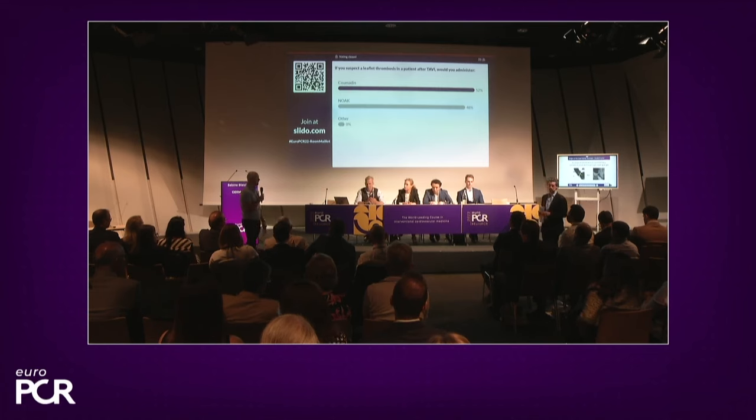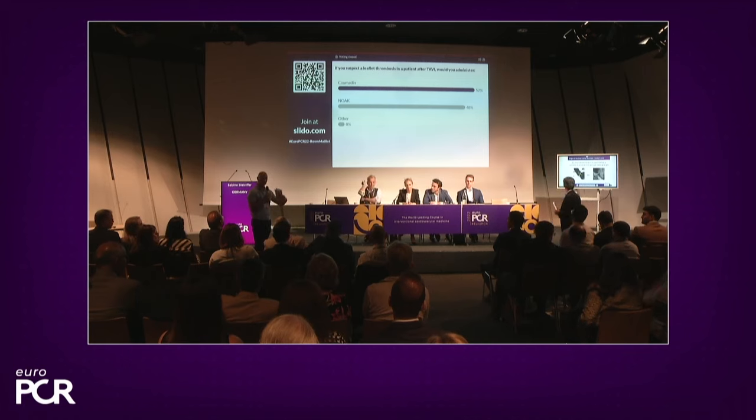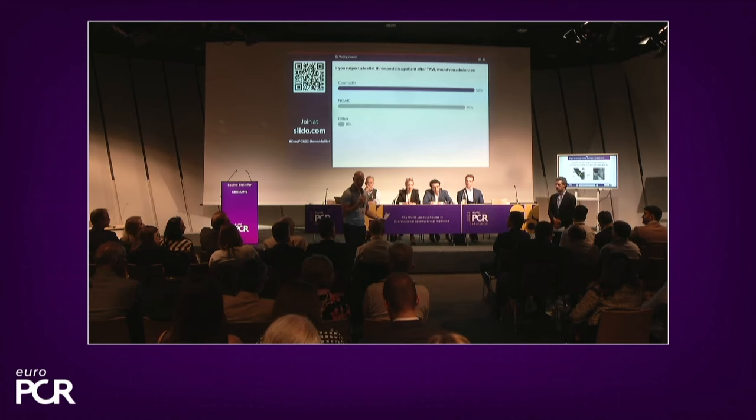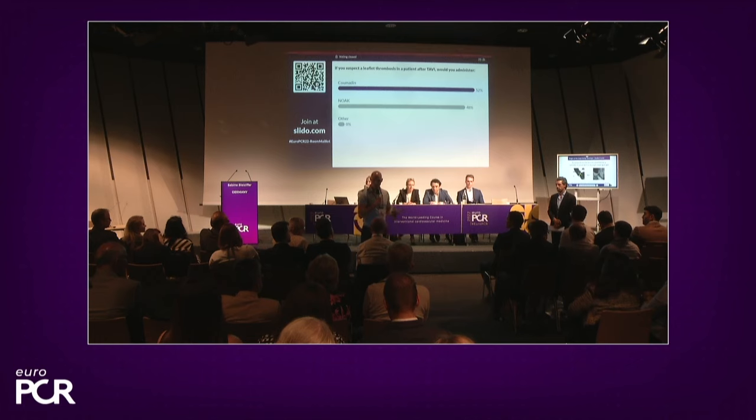Yeah. But I do see a lot of experts in the audience, and I do want to ask one of my friends a small question. If you have a patient with leaflet thrombosis, leaflet thickening, and there is an increase in gradient, you put the patient on a VKA, would you stop after 6 months, or, for instance, if the patient has no bleeding issues, would you continue? What is your take on that?